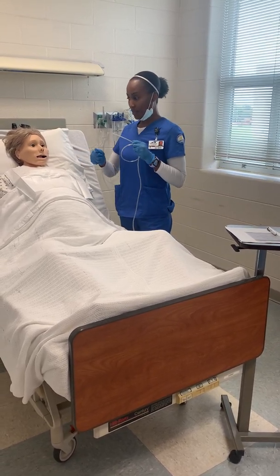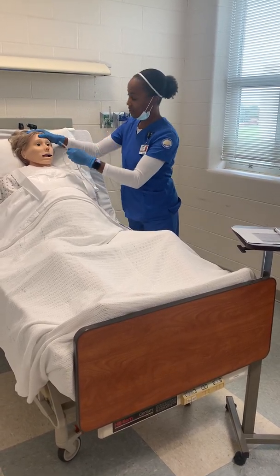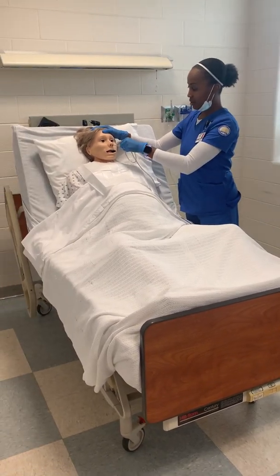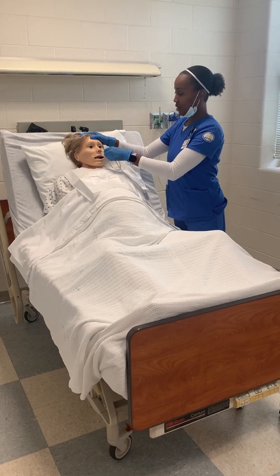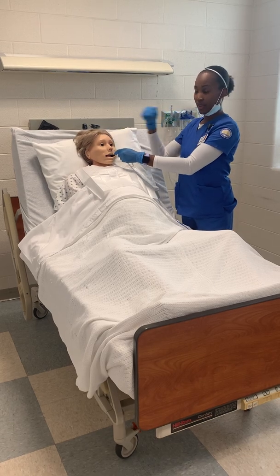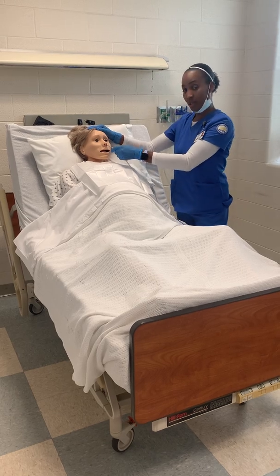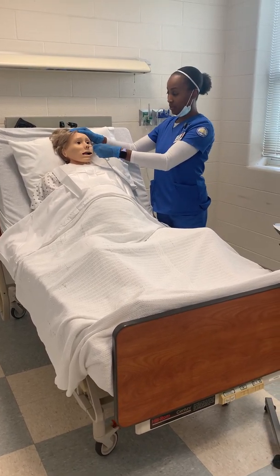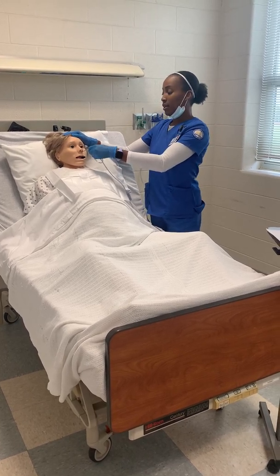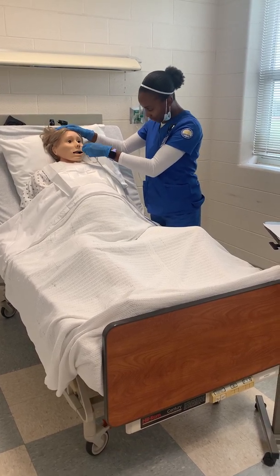I'm going to have her tilt her head back. So her head's back. I'm going to go ahead and insert. And I'll insert until it gets to the oropharynx. And then I will look in her mouth to make sure there's no coiling. If she was coughing, pull back a little bit until it subsides. So there's no coiling. Now I'm going to have her flex her head forward and continue to advance.